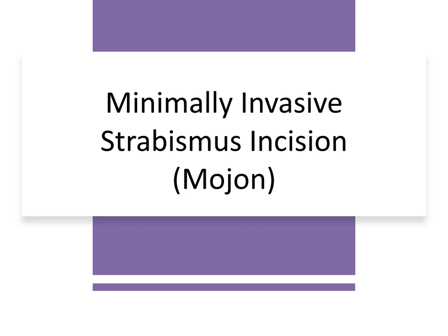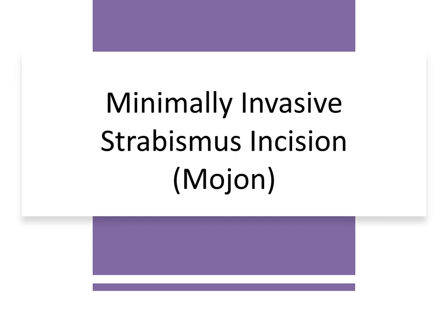Finally, we have the minimally invasive strabismus surgery incision described by Dr. Mojon. In this technique, two small incisions are made parallel to the muscle border to allow exposure of the muscle.